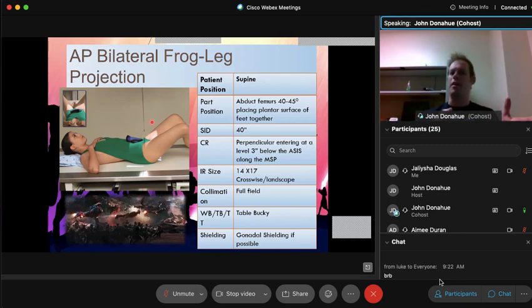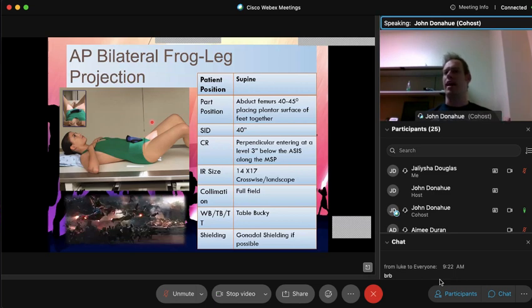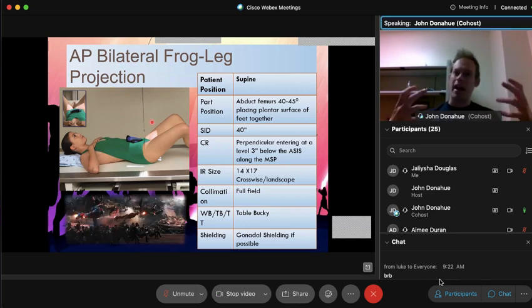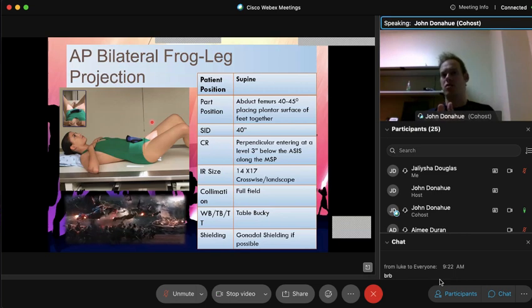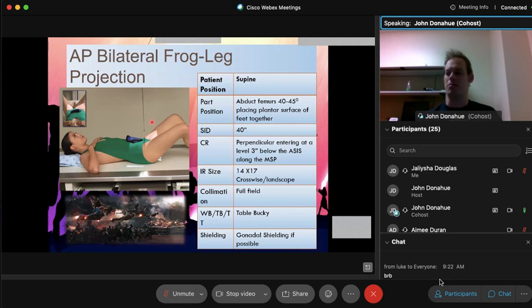That's why it's optional in females versus males. Males, we can always cover the sexual organs. For females, they're located a little bit higher. So it's a little bit more risky with the shielding aspect on females. And if you're really good at it, go for it. Because I always encourage shielding. But it is indeed optional for females just because it's going to risk covering up some of that pelvic anatomy. And you'll end up exposing them more if you have to repeat that x-ray because you covered something up. So always keep that in mind.